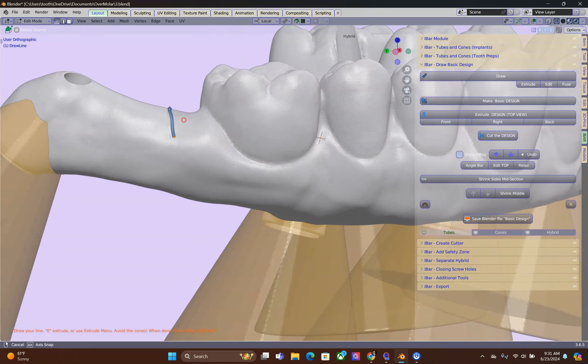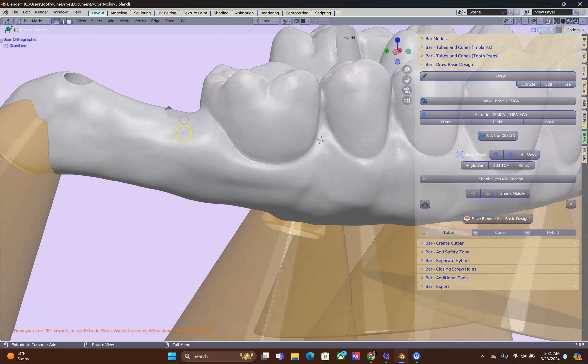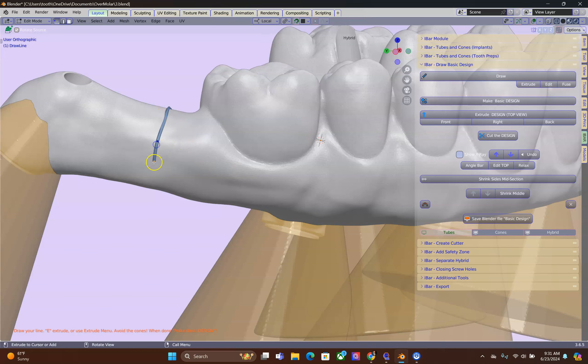So if you're doing it steep it's wrong so it has to be a gentle incline. Let me show you this is not correct. This is correct.